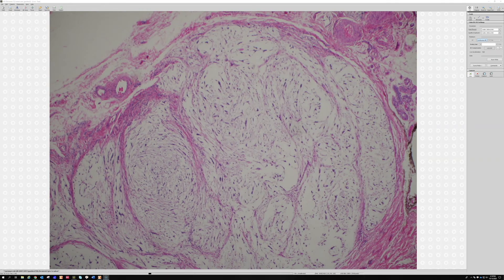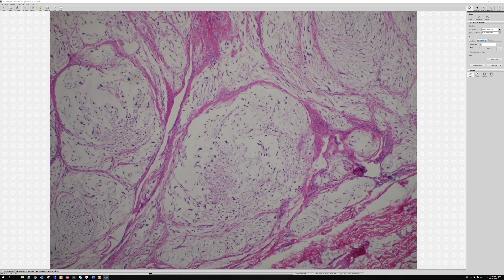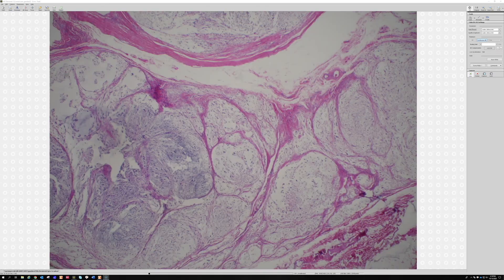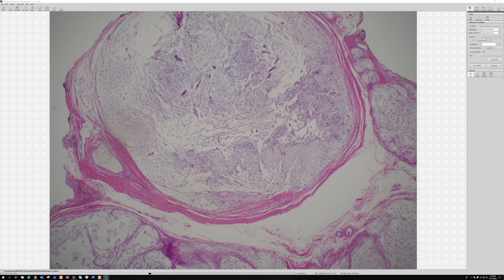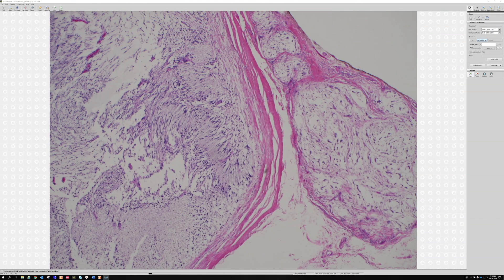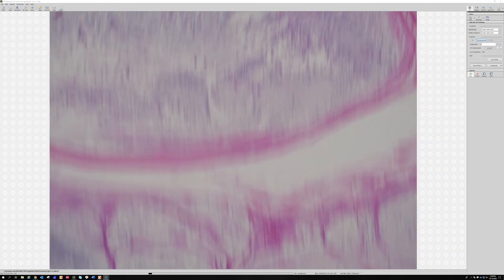Nerve sheath myxoma is unrelated to cellular neurothecioma, even though occasionally cellular neurothecioma can look similar. If you get cellular nodular areas alongside loose myxoid areas, you're dealing with cellular neurothecioma. Nerve sheath myxoma does not get cellular nodules, but cellular neurothecioma does get loose myxoid areas. This has been a source of endless confusion because the old literature has confusing, overlapping names. Look at that palisade — it really does look like a Verocay body. These are benign and can occasionally recur.